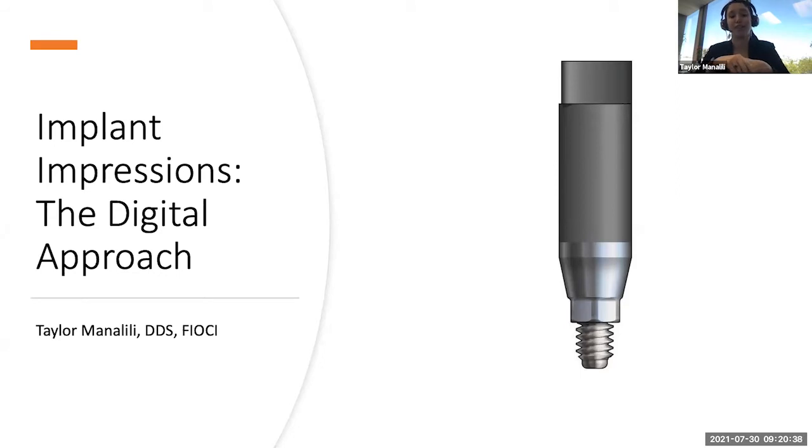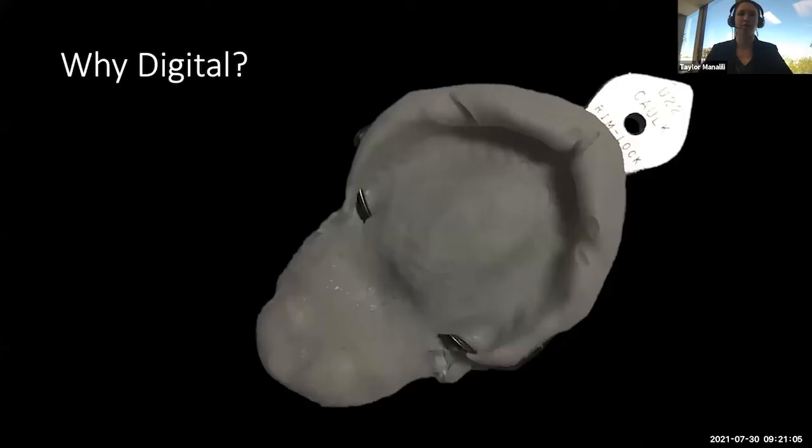We can do this either directly through taking our implant scans intraorally, or when your conventional impressions get to the lab, a lot of times they are then converted into a digital workflow. So we have our direct workflows or our indirect workflows. It's really exciting, that technology is really taking over and moving us in that direction.